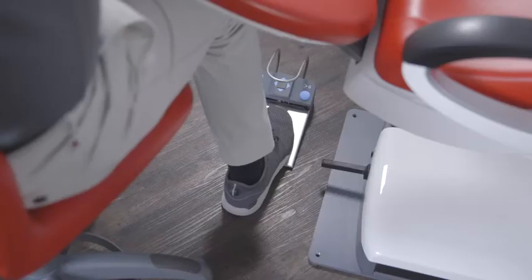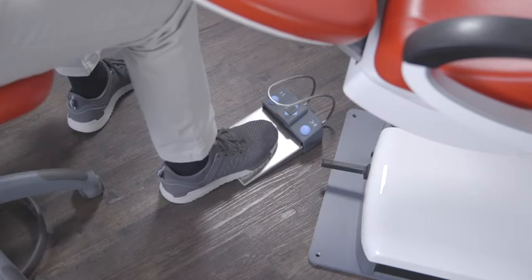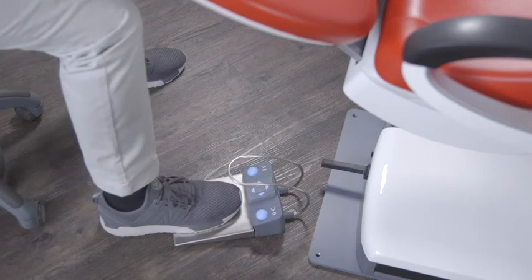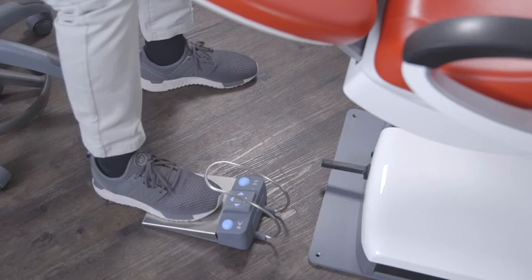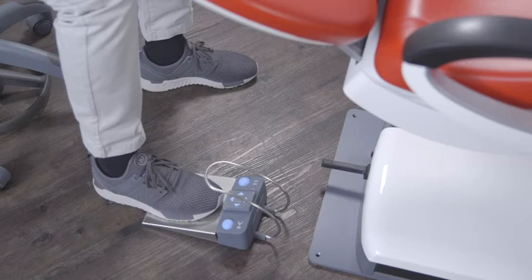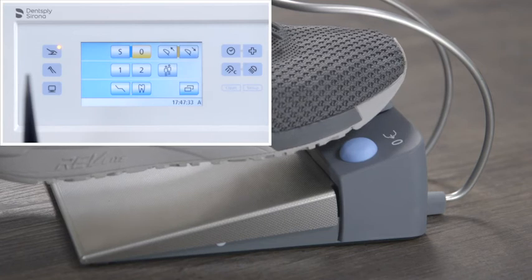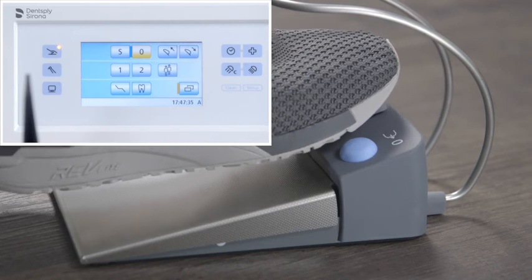Hands-free operation via foot control also contributes to optimal overall ergonomics. You can position the foot control flexibly depending on your treatment position. Only minimal effort is required to activate the foot control. The touch screen and the fixed keys of the dentist element can also be operated hands-free via the foot control.